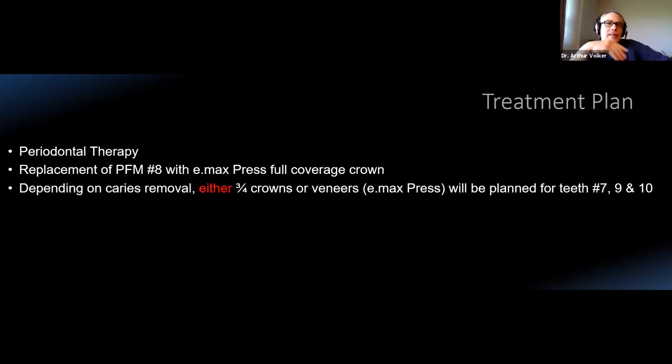But with the advent of resin cements and adhesive protocols and the ability to etch glass, my answer to what we're going to do to the other teeth does not depend on the restoration. It depends on what I find. So the only thing that's guiding me is really going to be caries removal and restoration removal. So what am I going to do on the other teeth?